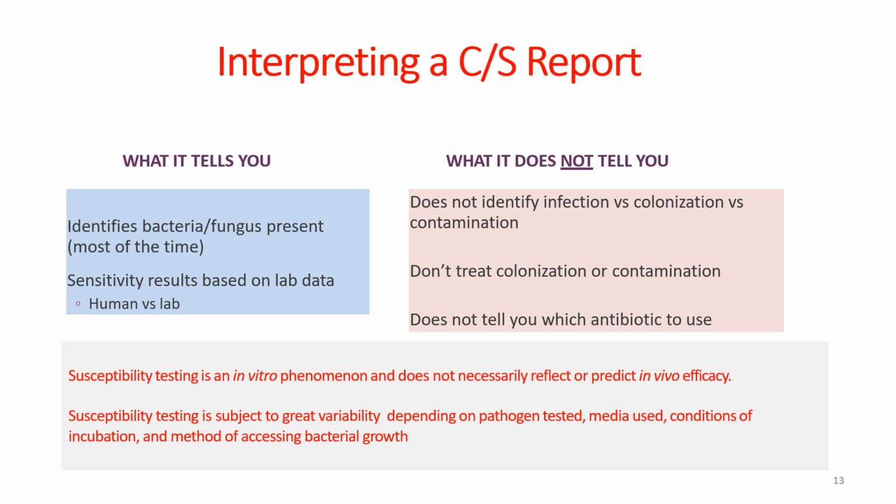Also, it needs to be borne in mind that sensitivity testing is an in vitro phenomenon, and it does not necessarily reflect the in vivo efficacy. Susceptibility testing is subject to great variability depending upon the testing in the labs, which type of pathogen is being tested, which media is being used, the conditions of incubation, and the method of assessing the bacterial growth.